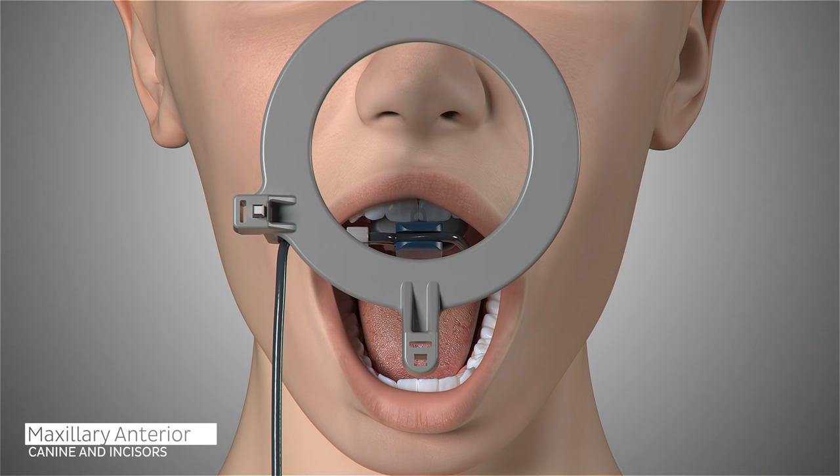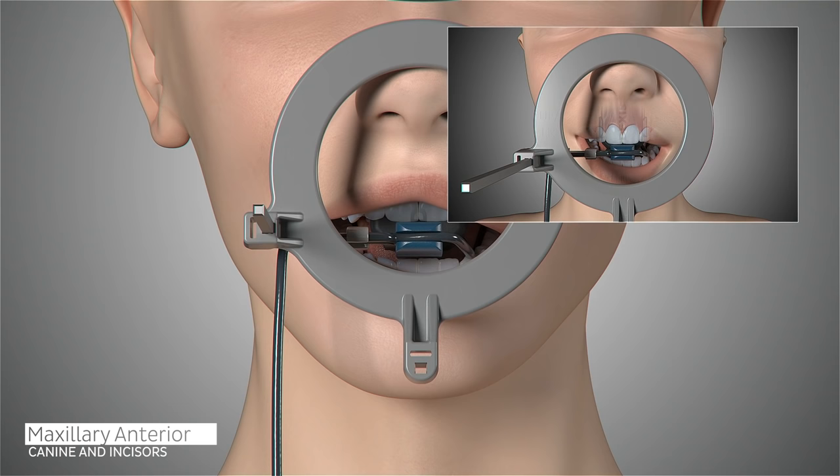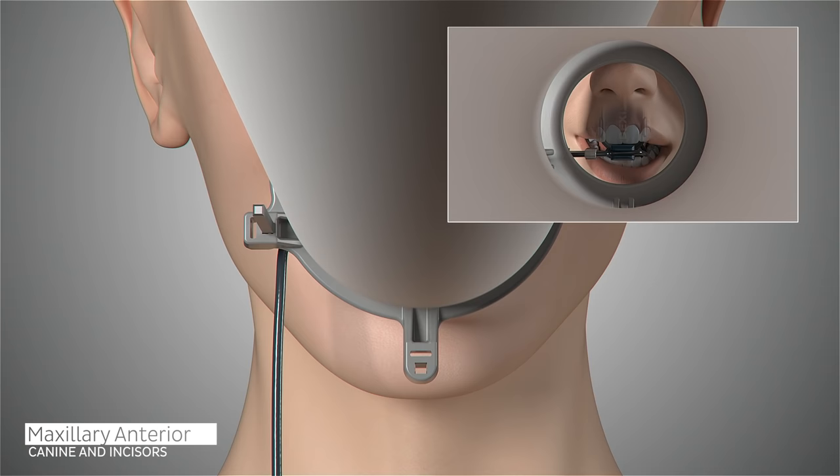Ask the patient to open slightly and reposition the sensor to the midline in order to capture the central incisors. Place the sensor well into the palatal region in the area of the second premolar. If the sensor is too close to the teeth, the palatal curve may prevent parallel placement. Ask the patient to close and slide the aiming ring as close to the patient's nose as possible. The cone of the x-ray emitter must be placed flush with the aiming ring and then trigger your exposure.